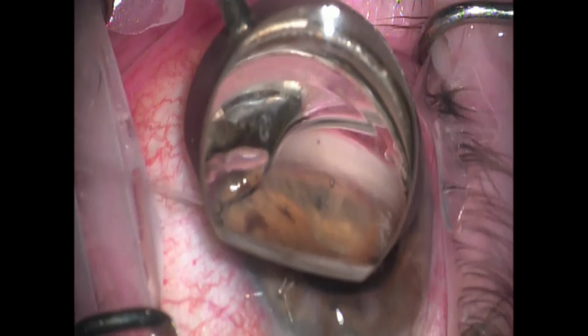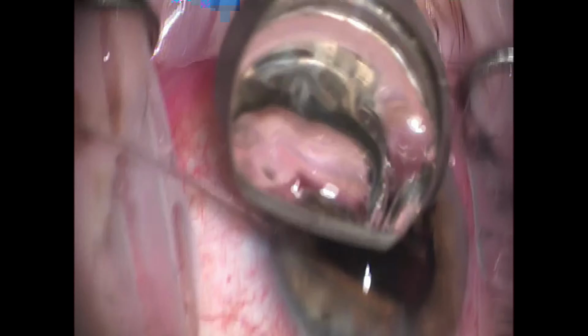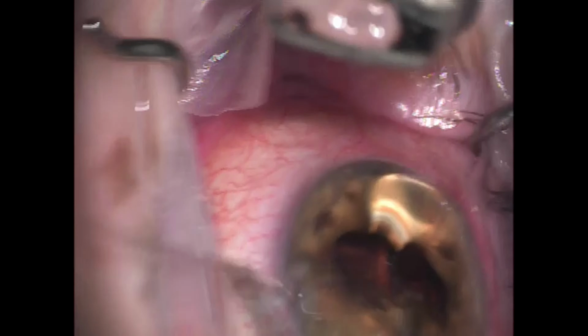I'm now pulling out, so this is the GAT. This is what further opens up the angle that was previously closed. I've had very, very good success with this procedure in my angle closure glaucoma patients.